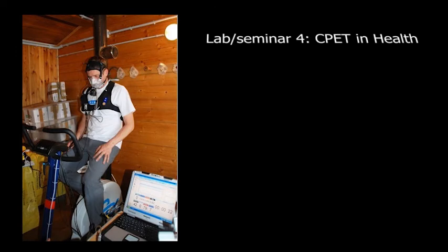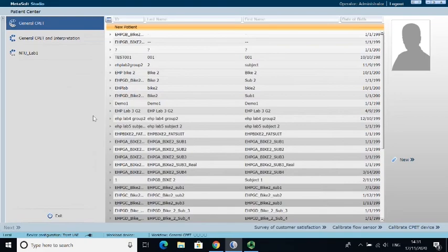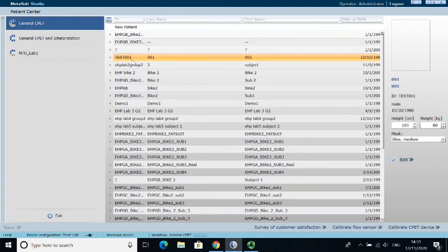So what we're going to do in this session is basically go through the screen that you would see on the computer and how to run the software, and then what some of the things mean. Right, so the first thing you're going to get is this opening screen where you get to either choose a previous participant or you get to select to use a new participant.